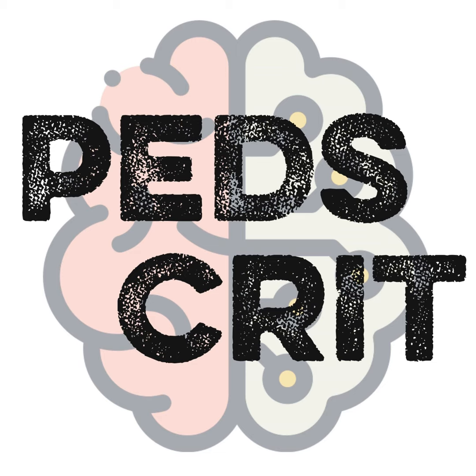So that's why, in the crucial 8 hours, these are some of the things that you closely watch to assess what the LV is doing. Pay close attention to your arterial line tracing, what the patient is doing, are you getting frothy pulmonary secretions? All of those things are important. And then chest X-ray, these are the things you pay attention to and sort of make a decision about, do we need to decompress this left atrium?